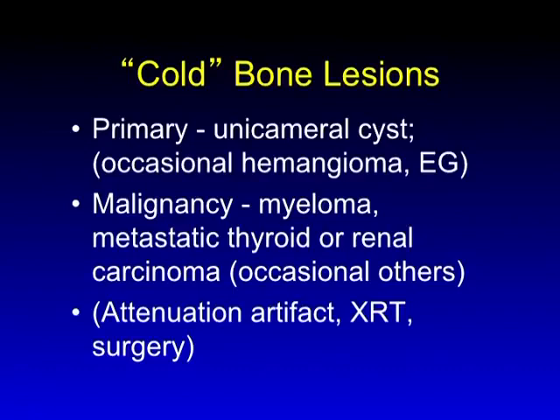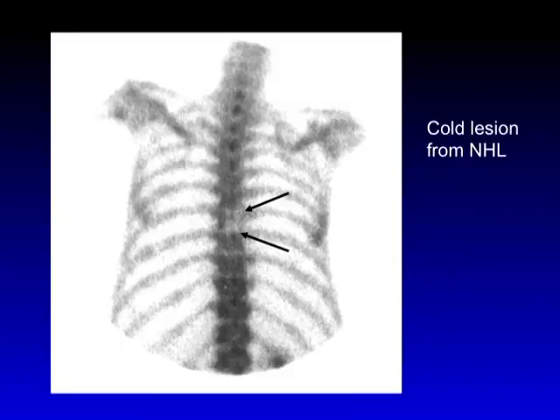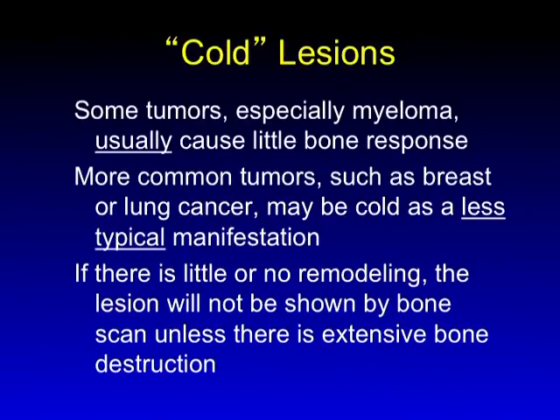Cold lesions are scenarios in which the bone has been eroded and there's no real uptake. These are hard to see and most are probably missed. Unicameral cysts are cold; most benign tumors are not that cold. If you see a cold lesion, usually it's malignancy. Plasmacytomas are notorious for being cold. Myeloma often presents as lesions too small to see. Metastatic thyroid and renal cell sometimes present as cold lesions. Here's a patient with back pain and a cold lesion — this was non-Hodgkin's lymphoma. Although some tumors like plasmacytoma have a real propensity to be cold lesions, others like lung cancer and breast cancer can present as cold lesions as a less typical manifestation. You're only going to see a cold lesion if there's a large zone of destruction.